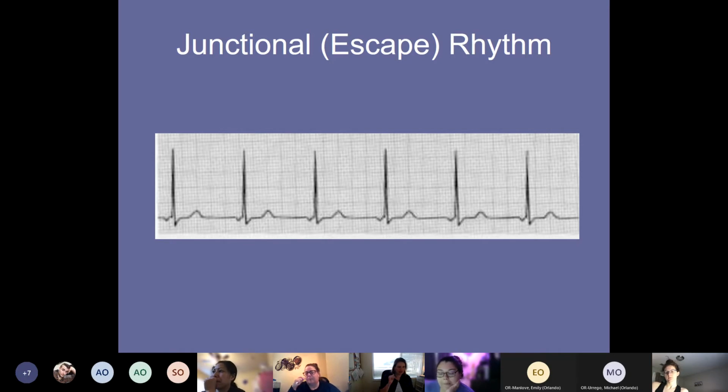Absolutely. And I think it's a little advanced. You guys need to know it, but that's tough. In lead 2, and this is lead 2, it doesn't say it, everything should be upright. It's the easiest lead to read. And so everything should be upright. So we can see that this is an issue. If we were reading a V lead or something that was reading from bottom to top, then everything would probably be upside down for the most part. Okay, right. Generally speaking. Okay, can I move on from this slide, or do you guys need another?